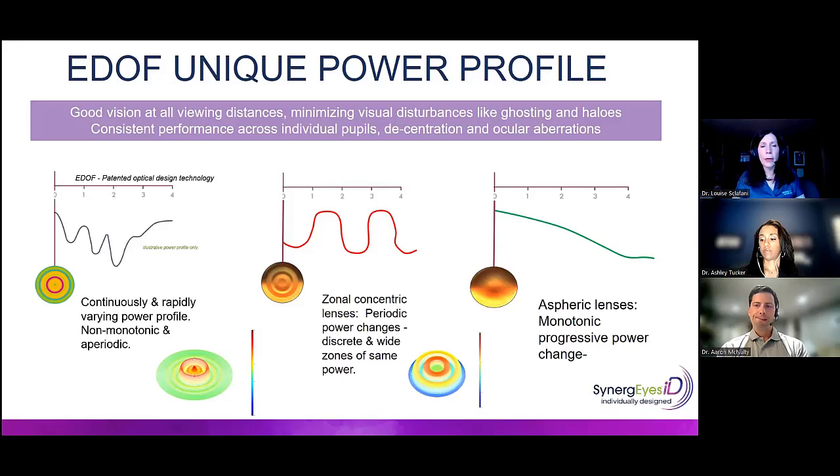Well, again, with the Brian Holden Vision Institute, after numerous studies, computer-generated models, and putting the lenses on different eyes and taking into account the aberrations of the natural eye along with refractive changes, they came up with this design. And it's been extremely successful in many populations.